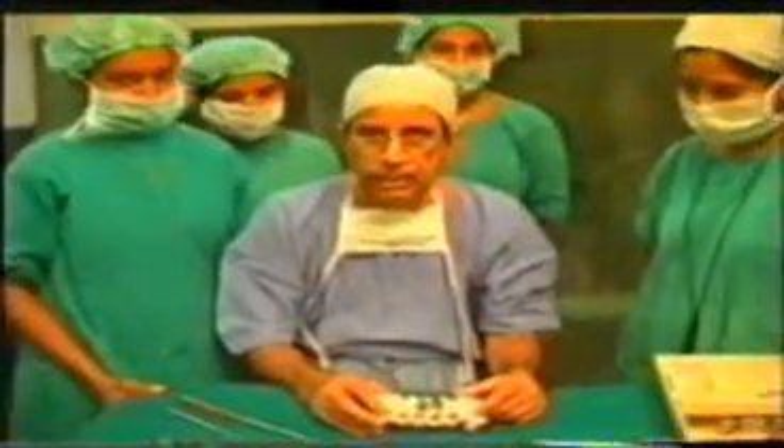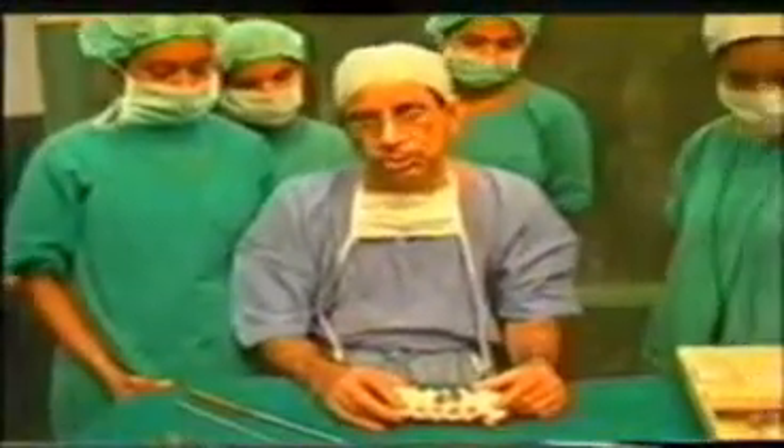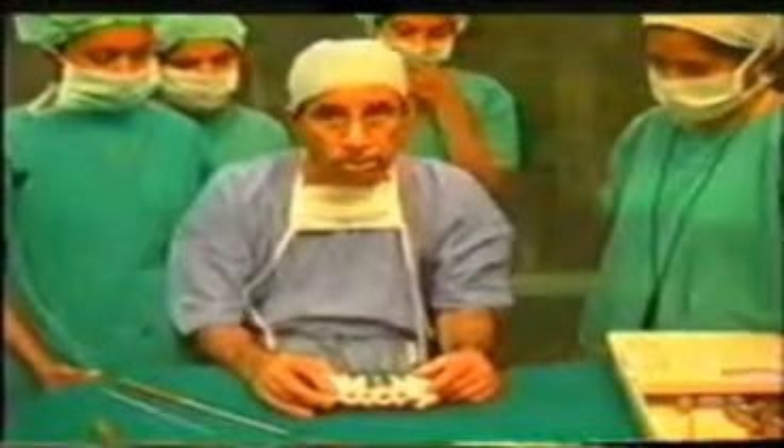These screws are not self-locking, and therefore there is a remote possibility that they can become loose. Because the screws themselves are not self-locking, we have a system by which you can lock the screws.